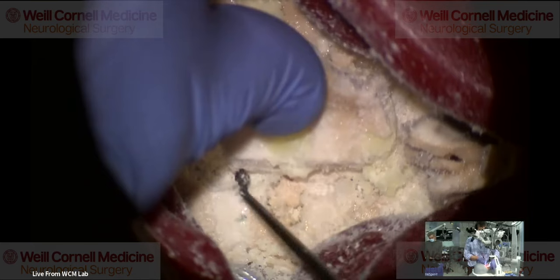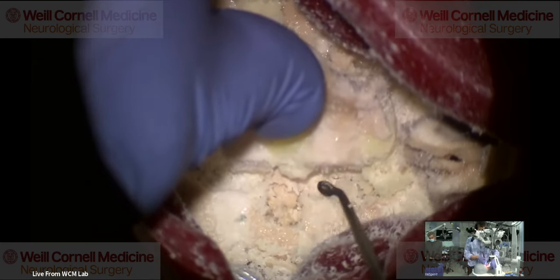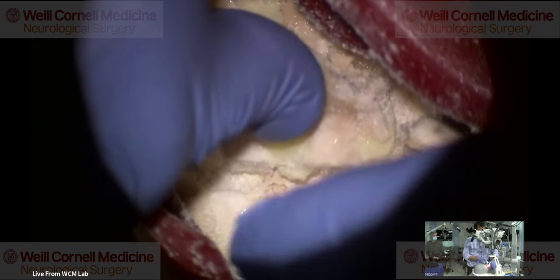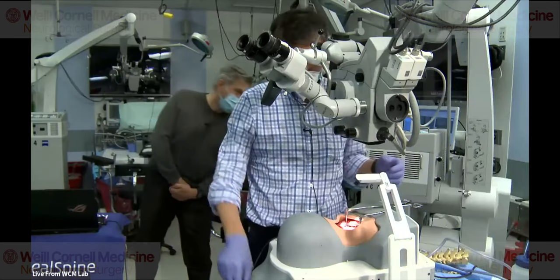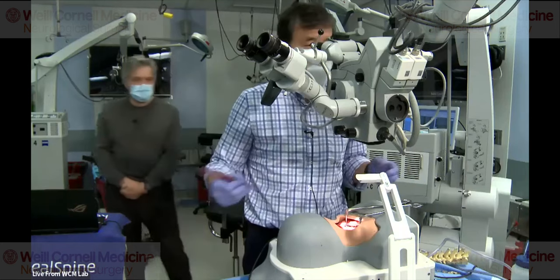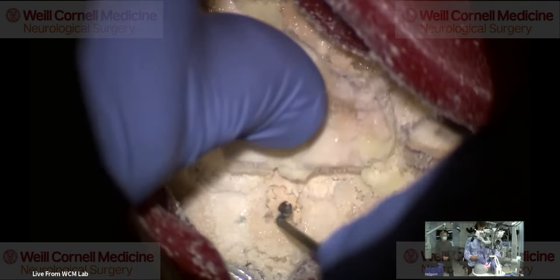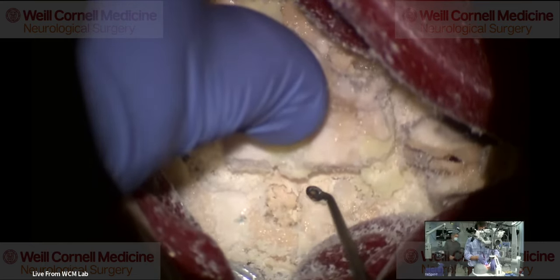Yeah. Now, if it starts to bleed, which it often does with an epidural bleeder, I just squirt some hemostatic, Surgiflo or FloSeal, whichever one you use. I just gently let it tamponade. Then I put a patty on top of it and wait about 10 seconds, and that usually seals it. Then you can lift it up. If it bleeds again, I do the same thing again, put some Surgicel on top, a little patty, and just hold it there.